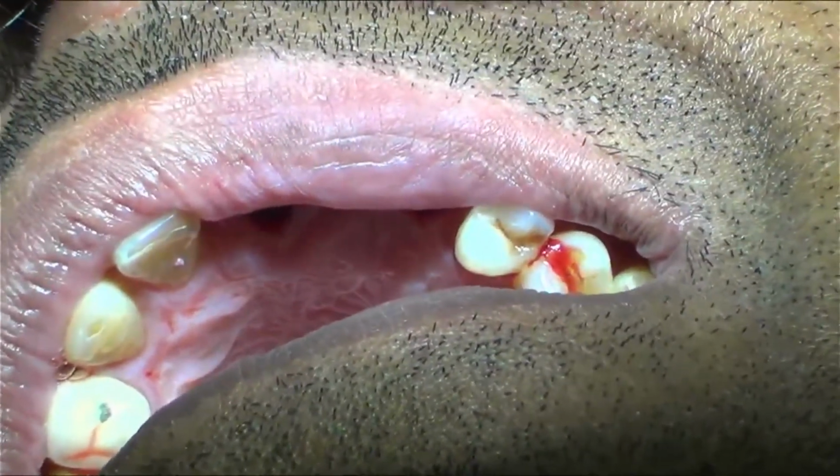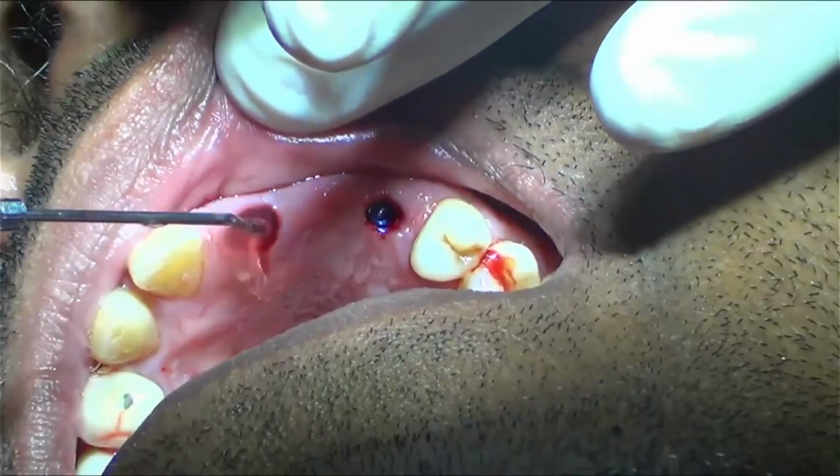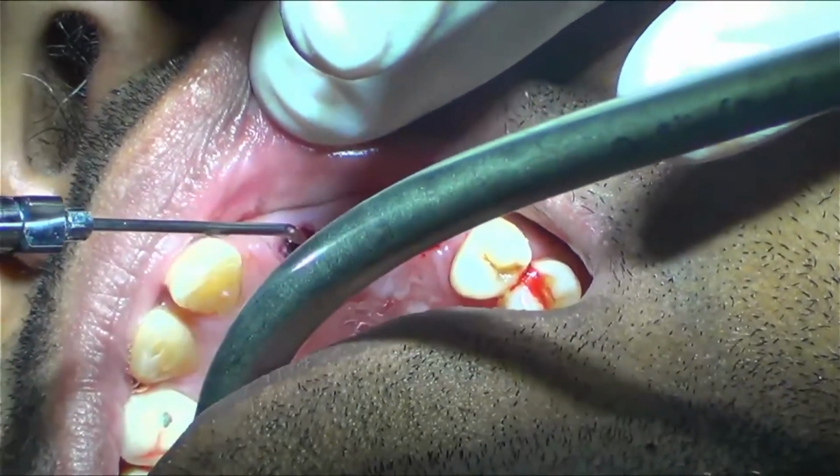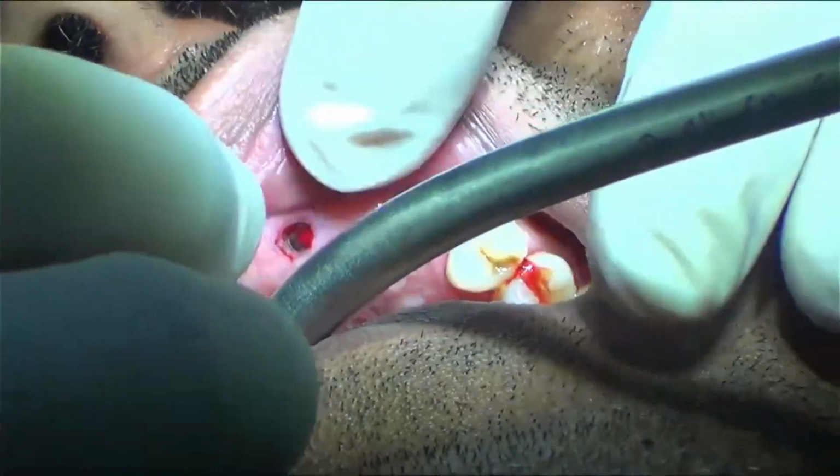You know, always you should irrigate the inside of your implant before putting the cover.